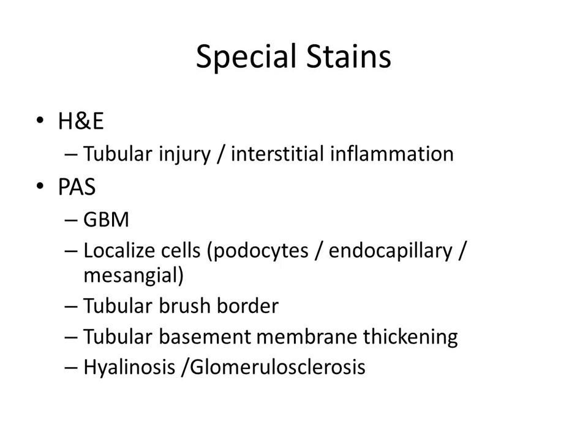The PAS is important for evaluating the brush border, especially of the proximal tubule. With early acute tubular injury, that brush border sloughs, and that would happen even before you have full-blown acute tubular necrosis. You would just have sloughing of the brush border and it would be gone. And those patients can be severely azotemic only with loss of the brush border. So sometimes that's your only hint that you actually have tubular injury. It's not full-blown necrosis. It's not coagulative necrosis. It's just sloughing of that brush border, and those patients will be severely azotemic, and that can be consistent with each other.